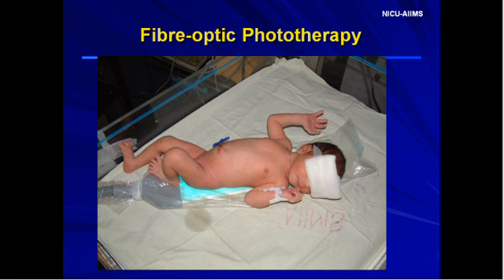This slide shows us the infant placed over a fiber optic phototherapy device. Fiber optic phototherapy can be used as the sole source of phototherapy or as an adjunct to conventional treatment. Insert panel into disposable cover so that it is flat and is directed towards the infant. Phototherapy pad is placed around the infant's back directly. Discard disposable cover after each application and when it is soiled. Connect the fiber optic panel to illuminator. Allow the lamp to cool for 10 to 20 minutes before moving the illuminator.